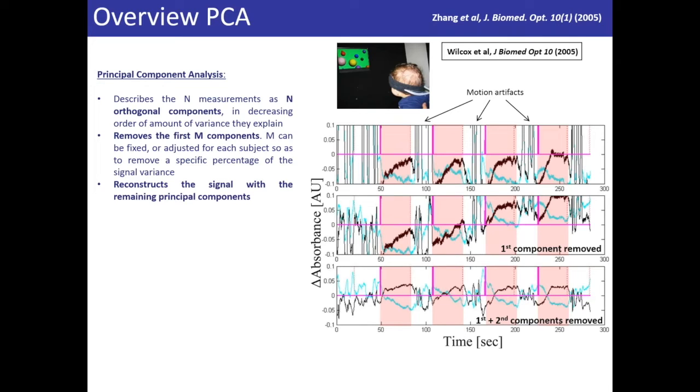But something else is also happening here. Not sure if you have noticed. If you look at the hemodynamic change, for instance, let's focus on this last block, this hemodynamic response versus the one on the third one here, after removal of two components. So it also reduced the brain activation related signal. Of course, because brain activation is also responsible for a certain part of the variance in the signal.